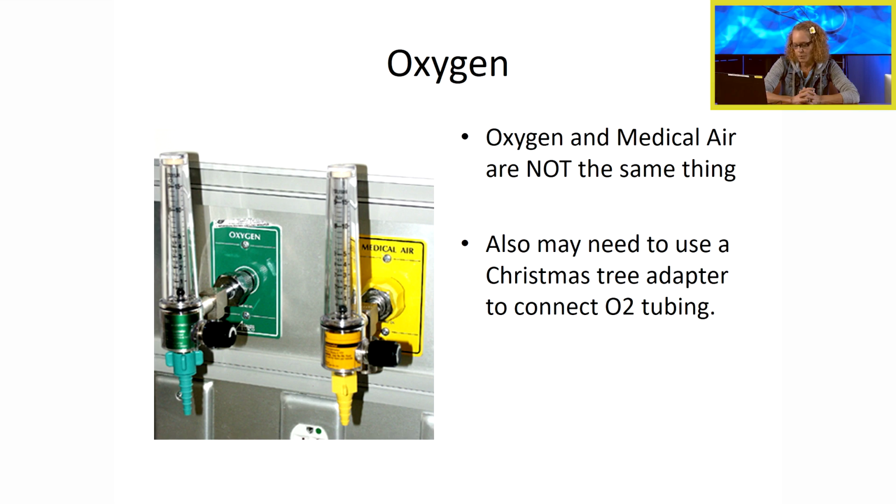the O2 tubing. So if anybody ever tells you, go get a Christmas tree, which is what somebody said to me once, I had no idea what they were talking about. And I was very embarrassed because I didn't understand the lingo. But that's what it's called. I guess it kind of looks like a Christmas tree. If I took it off and unscrewed it and turned it upside down, it's green. Go figure. But that's what a Christmas tree is.